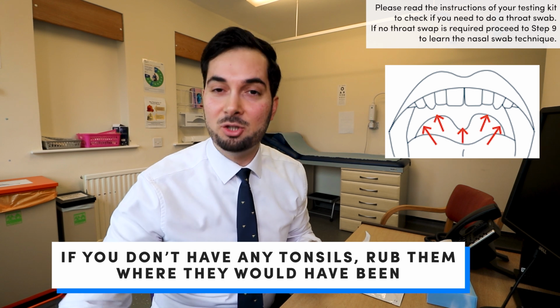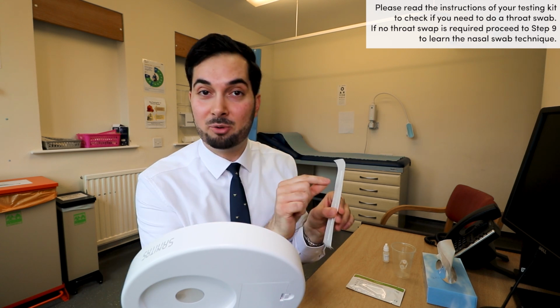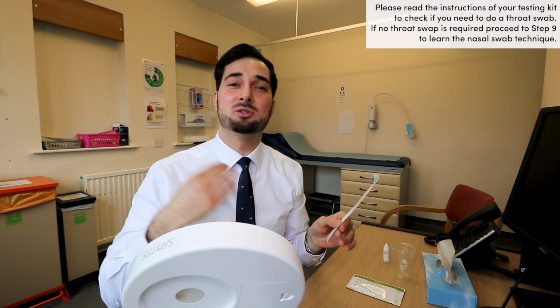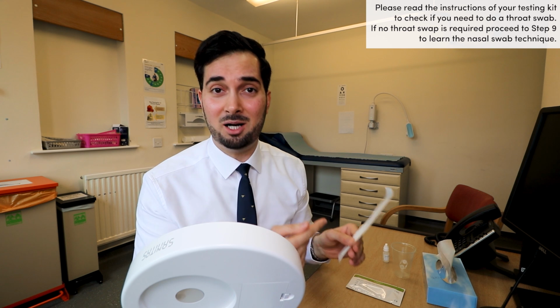I would highly recommend that you use a mirror, okay? It just makes life a lot easier for when you're trying to find where to actually place the fabric end of the swab and for rubbing. Also, please remember that the fabric end shouldn't touch your gums, it shouldn't touch your teeth, it shouldn't touch your tongue, because it can contaminate the result. So if it does do that, you're going to have to throw this away and start a new one.